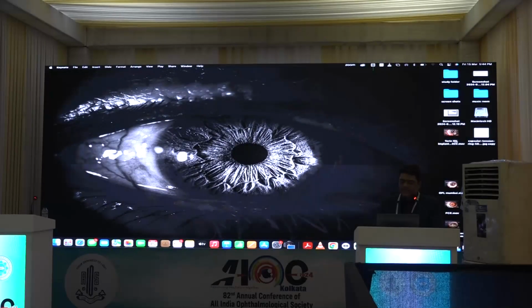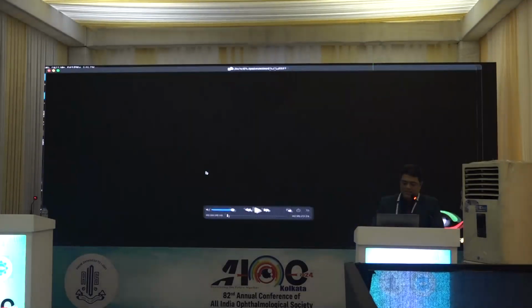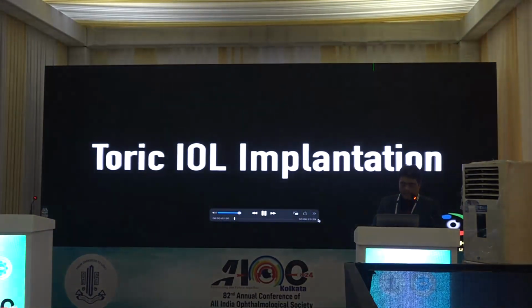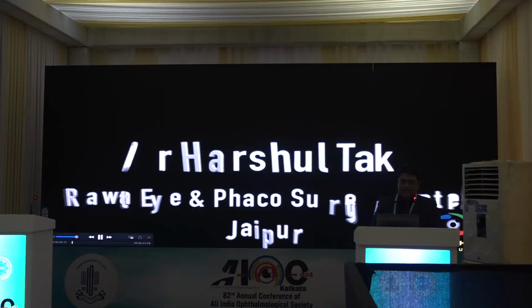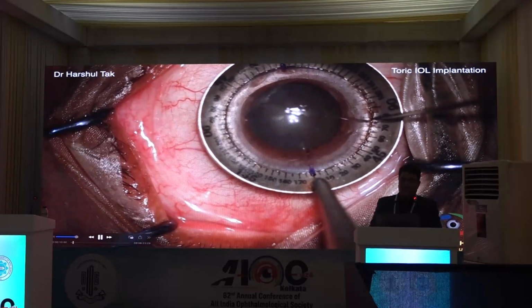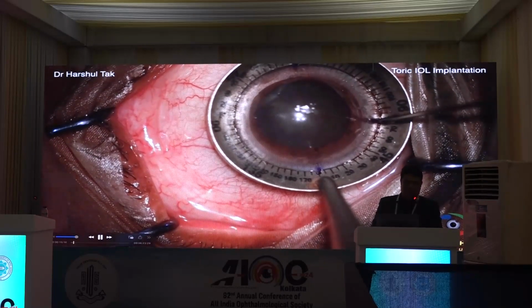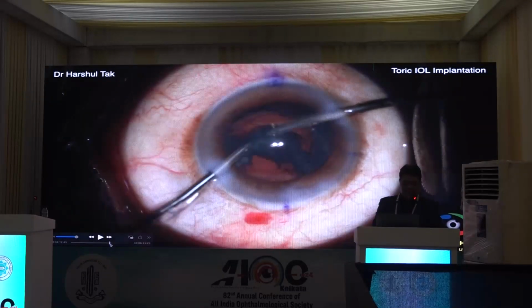And next, we are talking about implantation of IOL. So what I described in 2010, the technique of hydroimplantation, and I coined this term, and this technique is very useful in toric and multifocal and trifocal cases, because we all know that if we have any residual OVD left behind the IOL optic, it may cause post-operative rotation of the toric IOL. So we should always try to use this technique, hydroimplantation.